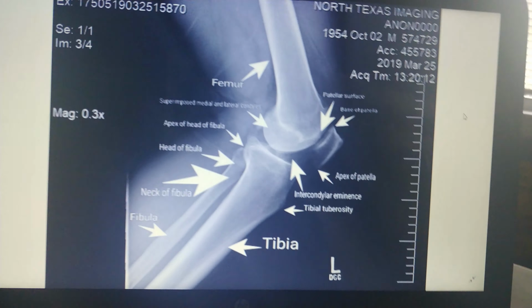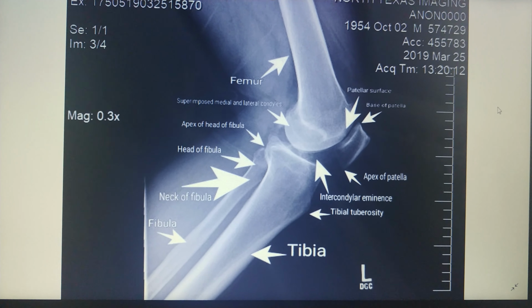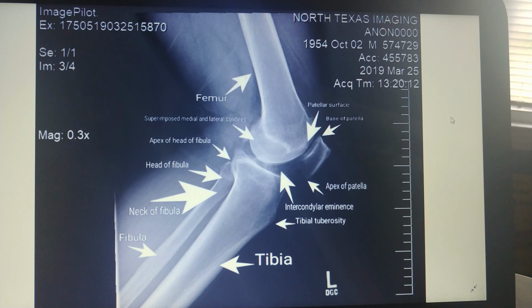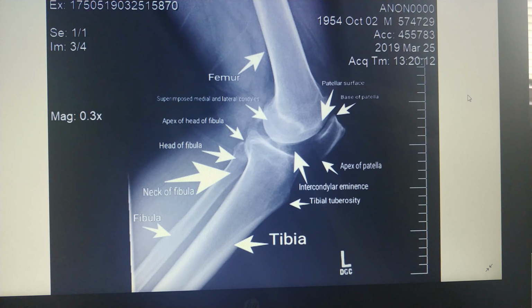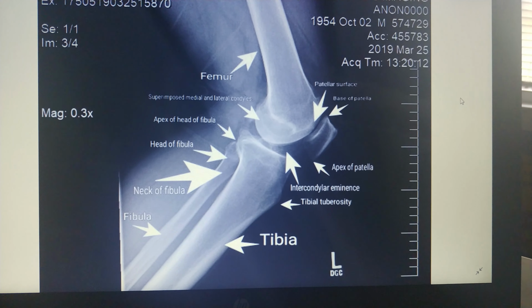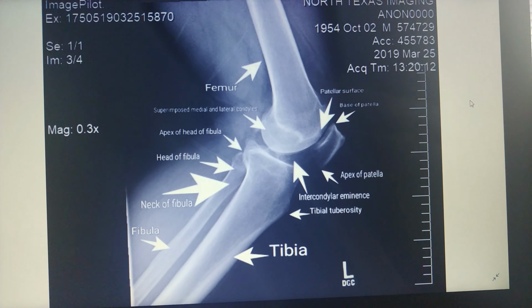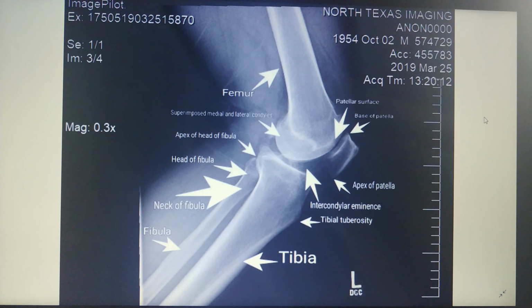The start of the exam began as most others do. I set up the room beforehand if I get a chance to know exactly what X-rays I'm going to be taking. In this case, I saw that they were standing bilateral knees, so ahead of time I set up the room for that. This consisted of lowering the wall bucky as low as I could, and I'll adjust when I see the patient. I'd bring the X-ray tube at 40-inch SID in a horizontal beam and align it with the wall bucky. I then put in the IR in a horizontal orientation, and at that point, I'm ready to go get the patient.